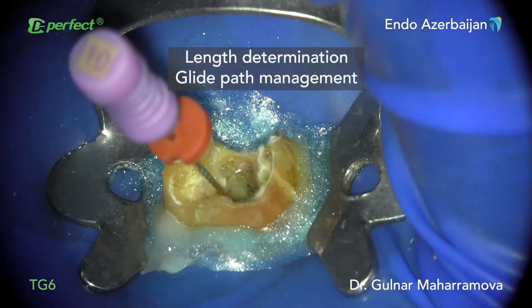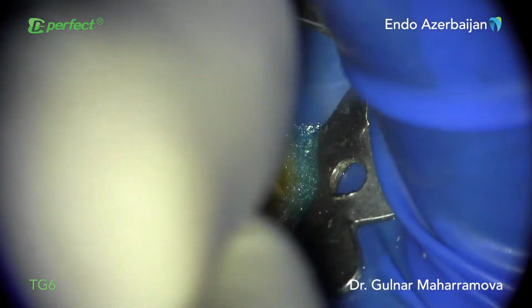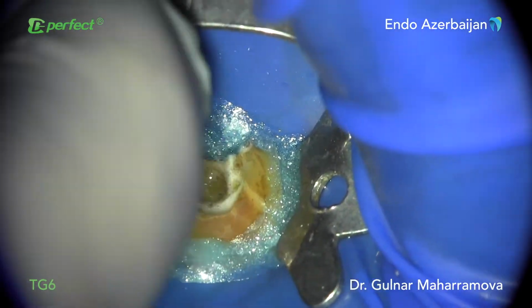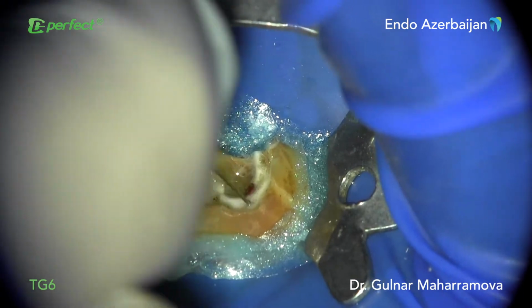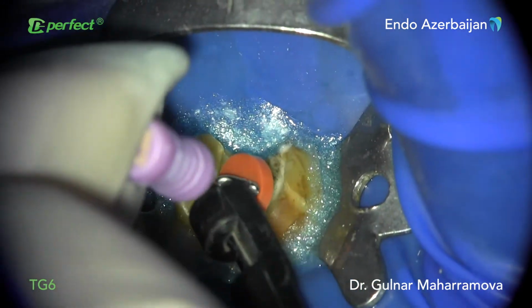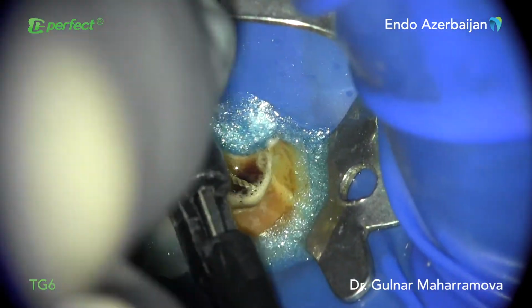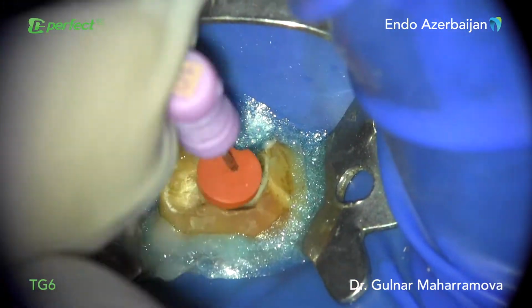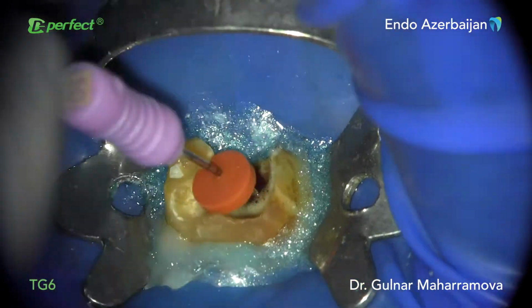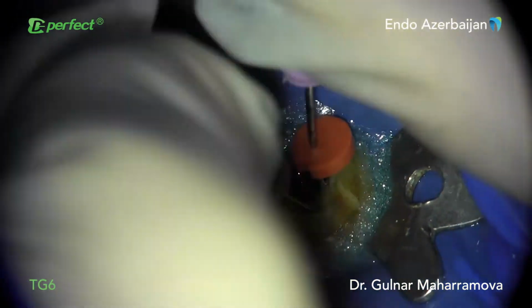The next step was to scout and to establish a glide path, as well as to obtain a working length by using electronic apex locator. The X-ray was taken to confirm the showings of the apex locator. 5.25% sodium hypochlorite is used throughout the shaping, following each file to wash out debris and disinfect the root canal space.